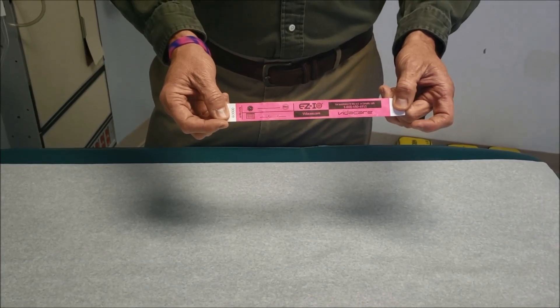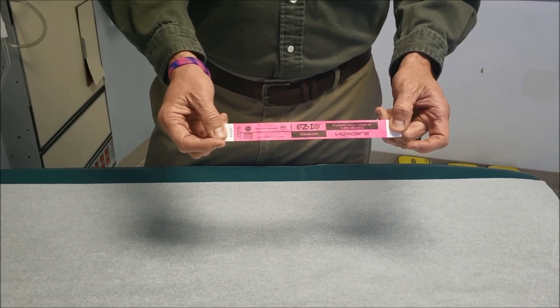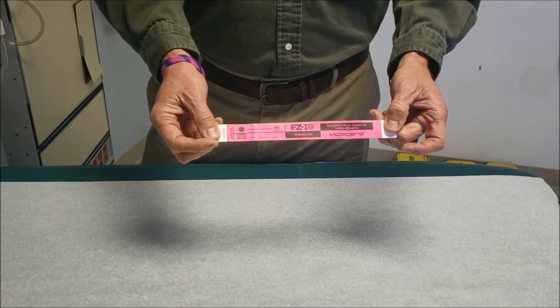Please don't forget after inserting the EZIO to attach an armband to your patient, which documents the date and the time that it was inserted. That has to be removed per policy within 24 hours.